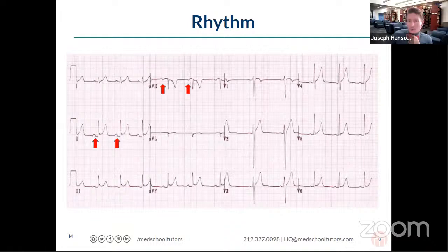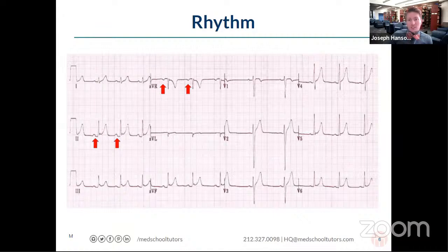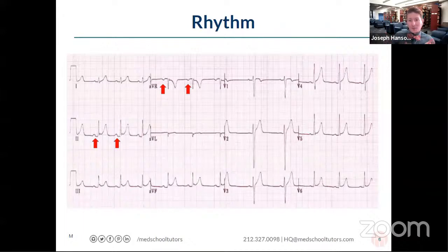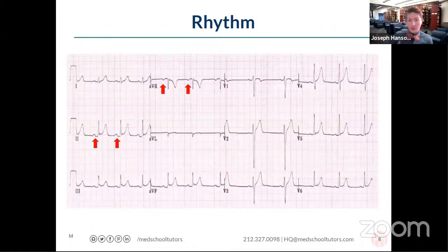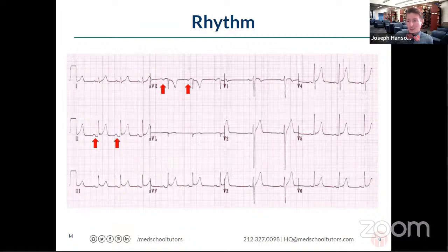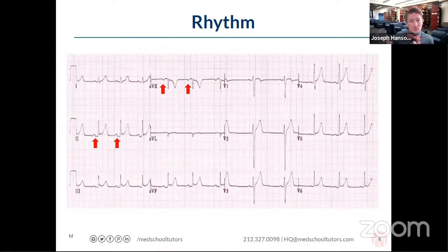The thing you're going to get pimped on on the wards is what constitutes a sinus rhythm, and this also applies to exams: we want a P wave for every QRS and a QRS for every P wave. You have to say both parts. A P wave without a QRS means the SA node is firing with no ventricular depolarization. A QRS without a P wave means the ventricles depolarized spontaneously without the SA node. By definition, sinus rhythm means the SA node is in control, requiring a one-to-one ratio between P waves and QRS complexes.